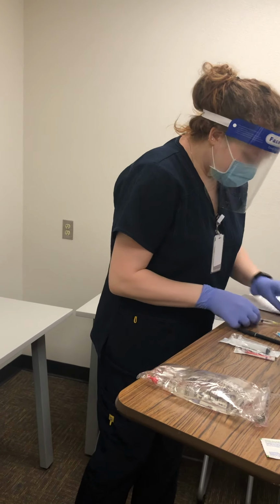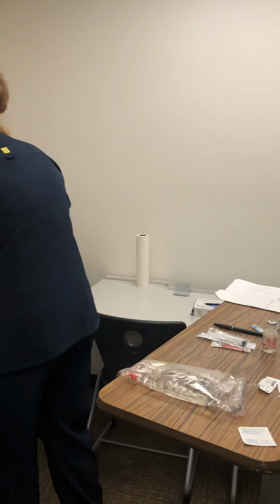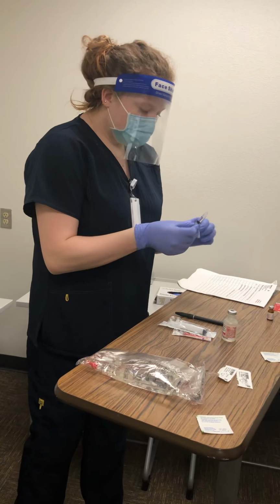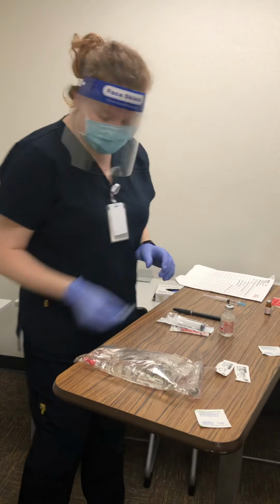So I'm going to use my needle. I'm disposing of my needle in my sharps container, and this can be disposed of in there. So now I'm just going to put a cap on this to keep the end clean during transport.